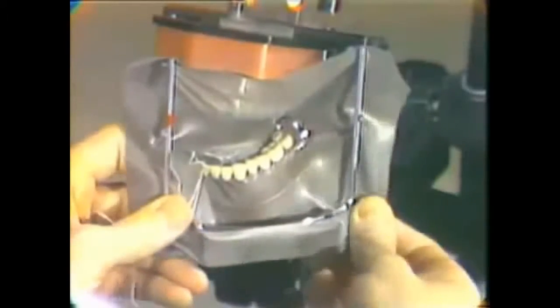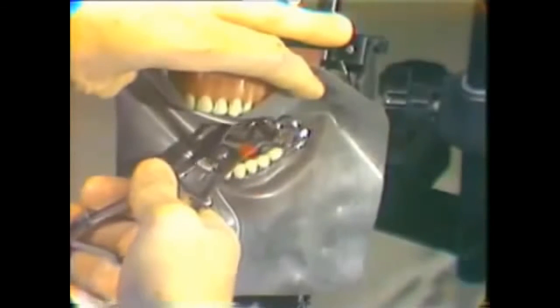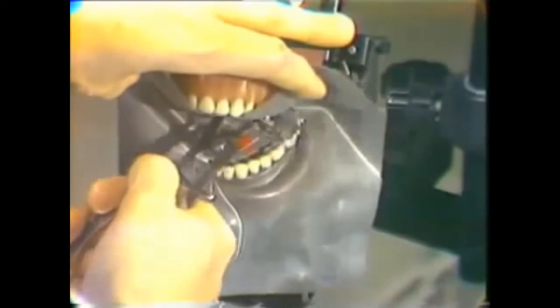The removal procedure is now rather simple, but must be done carefully. First, the rubber dam is going to be disengaged from the frame, and the frame will be removed first. The rubber dam clamp forceps engage the clamp and remove the clamp. The ligature was taken out of the most anterior tooth, the area that was being retained there.